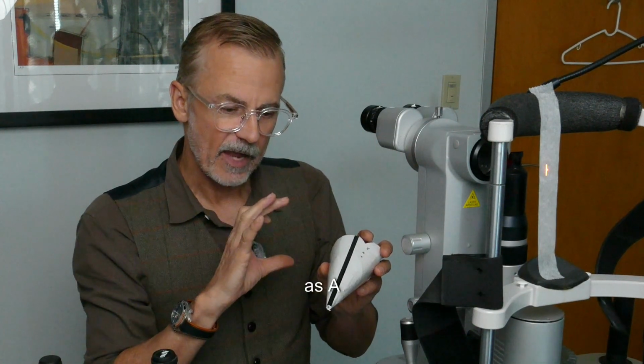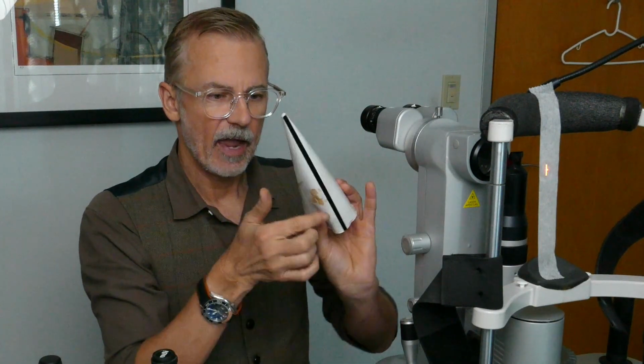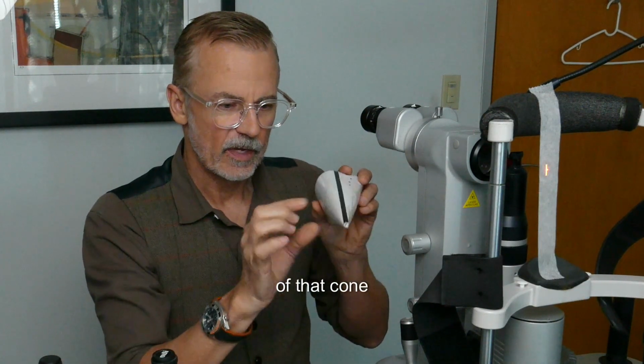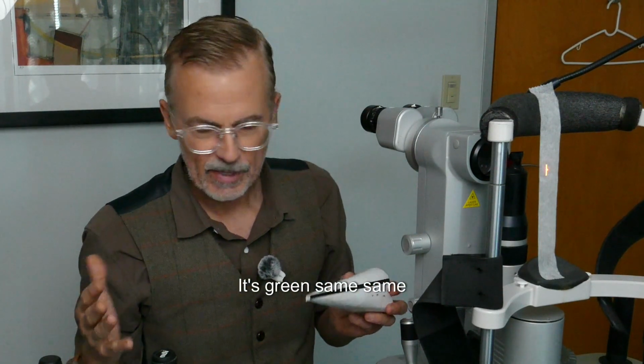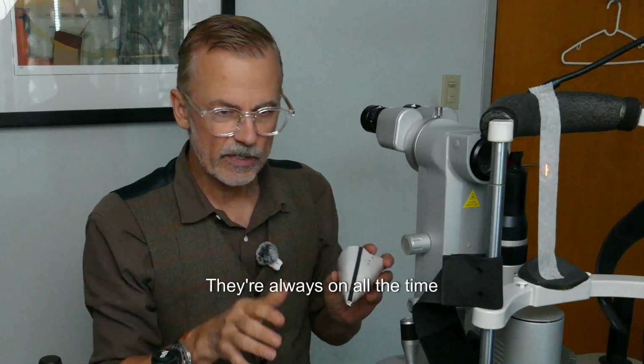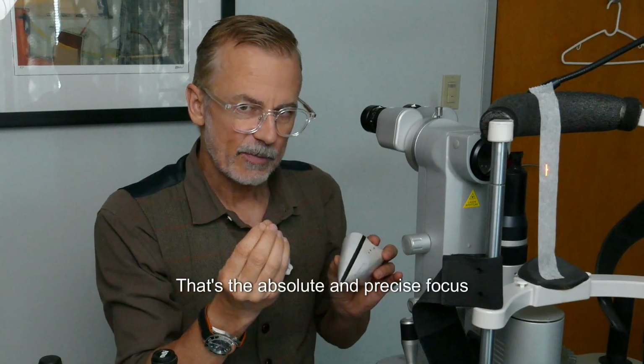But as a focusing aid, along the top and the bottom of that cone are focusing beams. In the case of the Ultra Q, it's red. In the case of the Ultra Q Reflex, it's green. Same. Low-level energy lights, they're always on all the time. And where those two energy beams come together, that's the absolute and precise focus of that laser.